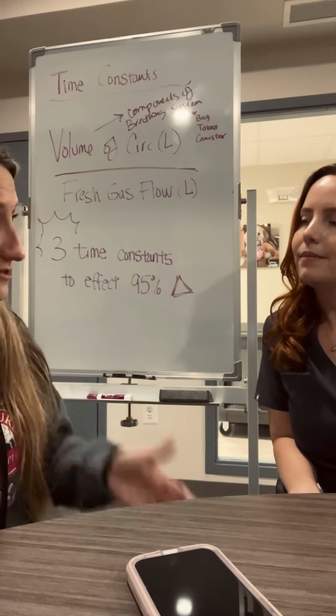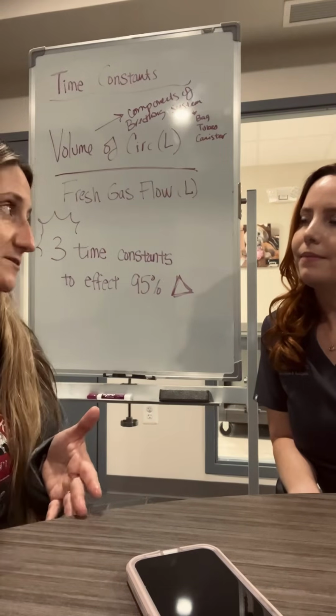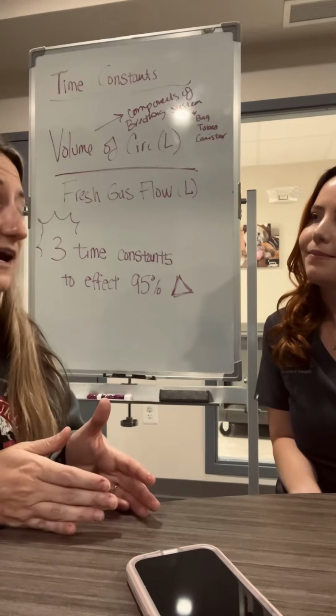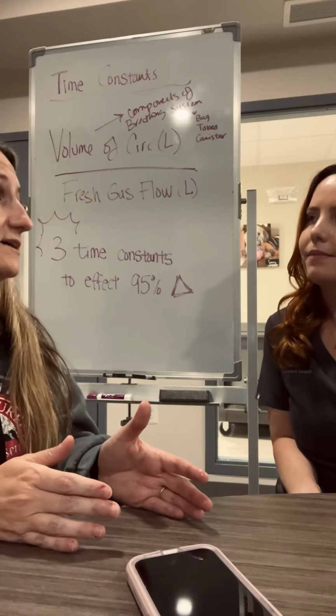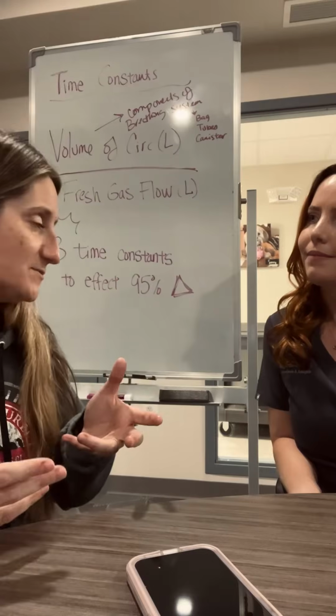On the anesthesia nerds, Stephen and I were actually talking about how if we have an IV catheter and we have some leftover injectable induction agent, we'll prefer to do that because it's a little faster. But can you walk us through why it's actually faster? Or again, if we didn't have an induction agent and we were going to rely on changing our anesthetic depth quickly, utilizing the flow meter and the vaporizer, what's the science behind that?